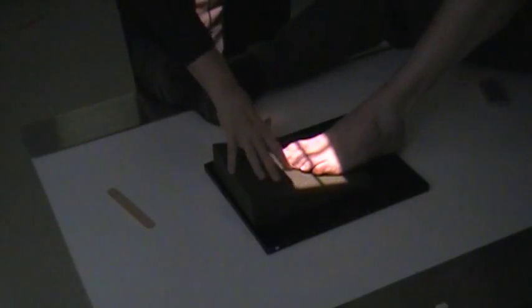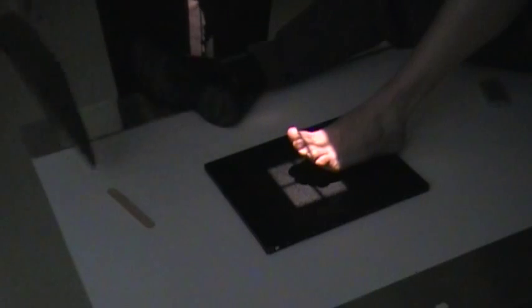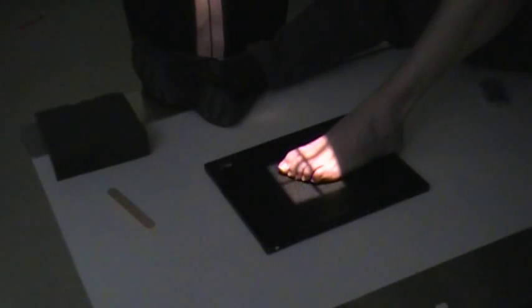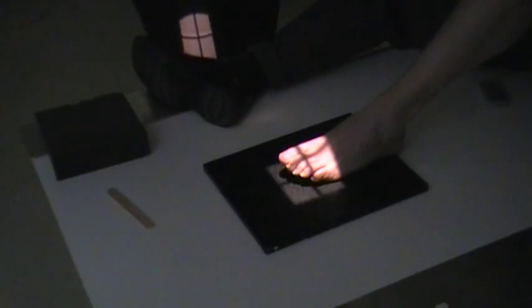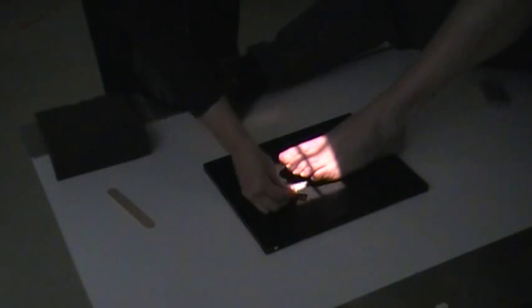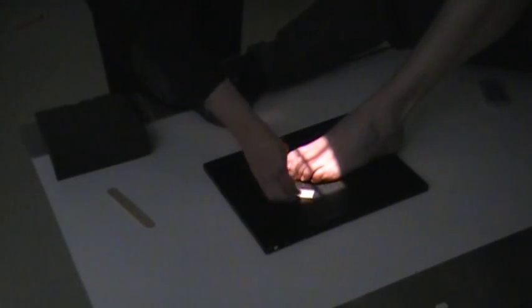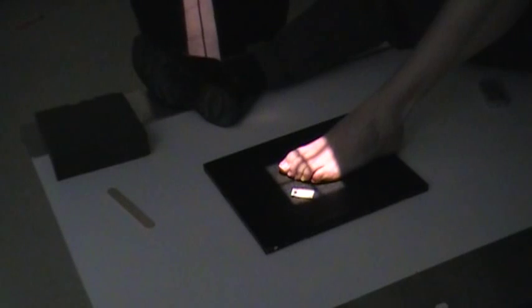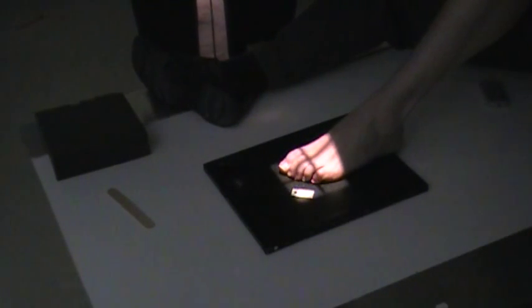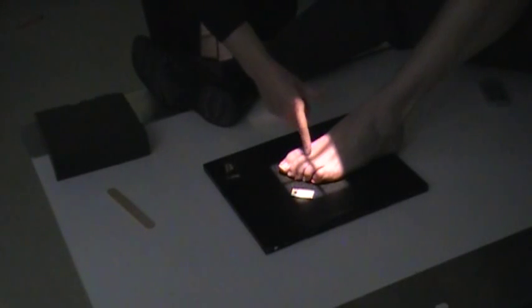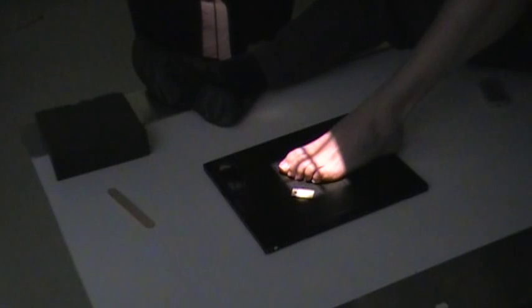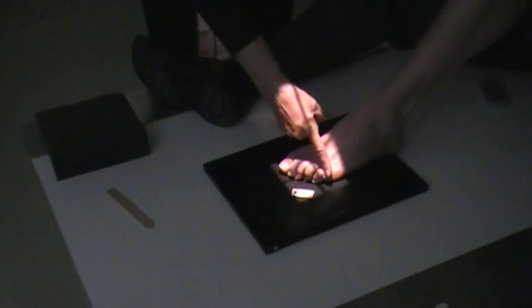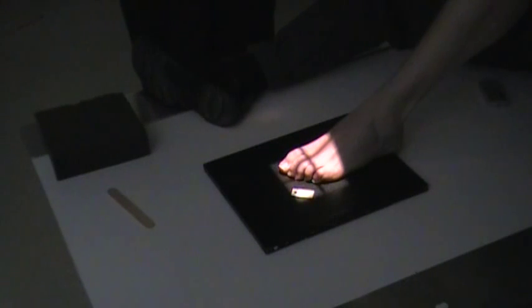Just be sure once you do this that you do have a sponge which you can wipe clean after having the patient's foot on the IR. For our AP, be sure you mark the correct side. You're going to have the central ray cutting across here at the joint space of the metatarsals and the digits, right across this metatarsal phalangeal area.